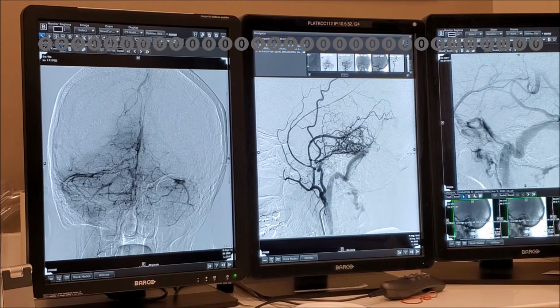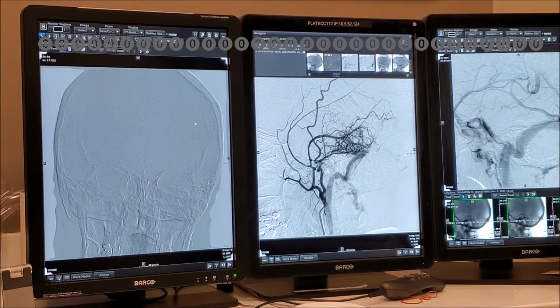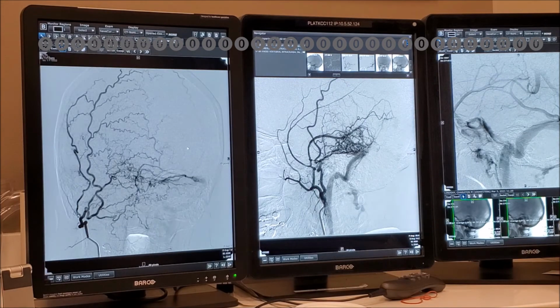You may want to put a catheter in the right side, because remember, the right side came. Maybe the right side is the highest point. Remember when we did the right external? Okay, let's say this one. You see, it shows you the higher part. See, here's the sinus. Again, collateral circulation helps us to answer the question.